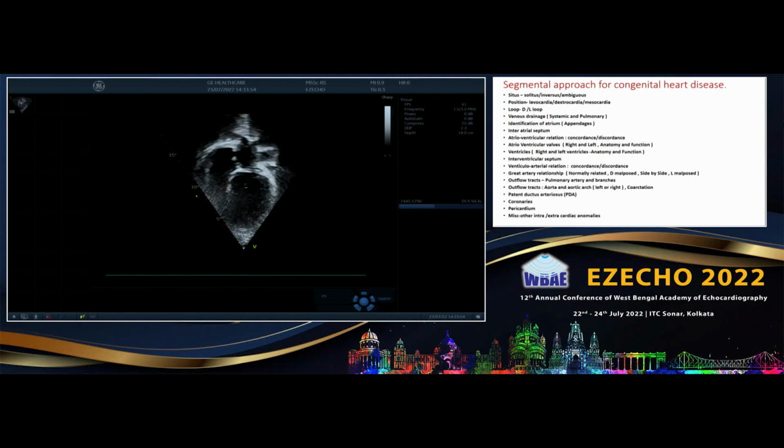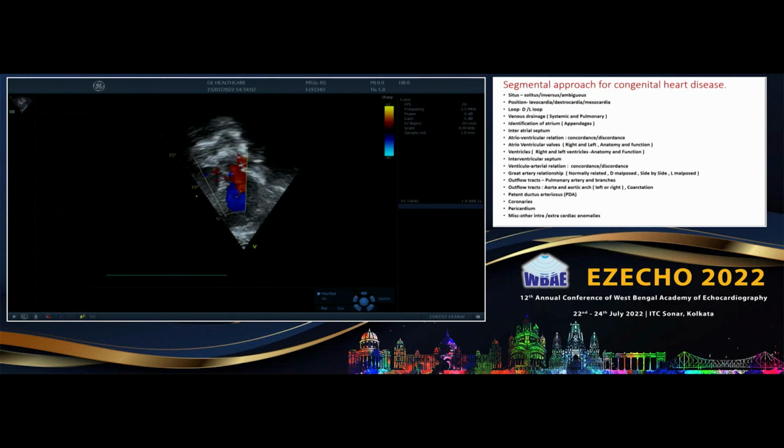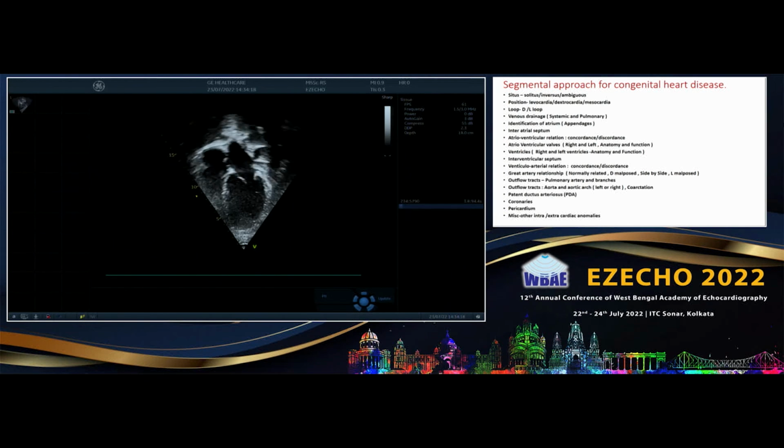Restrictive, the child will be doing well, the LV will not be that much dilated. So in the moderate one, there may be difficulty. That is approximation. So by trying from different views, we try to align the best possible. But the decision is taken holistically, not only based on a single gradient number. How much is the LV dilatation, how much is the impact on the growth of the child, etc. Then the overall decision is taken for a moderate VSD.